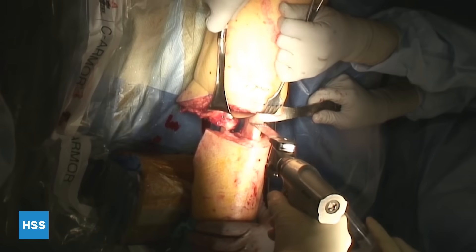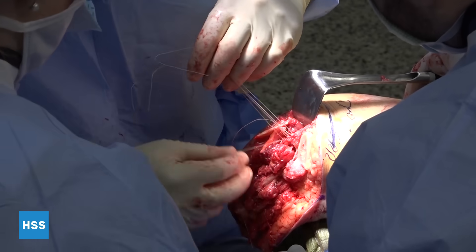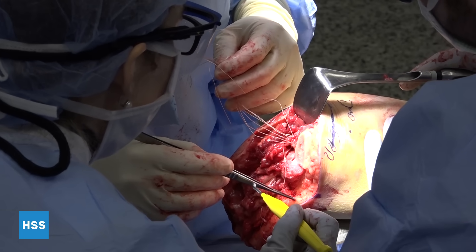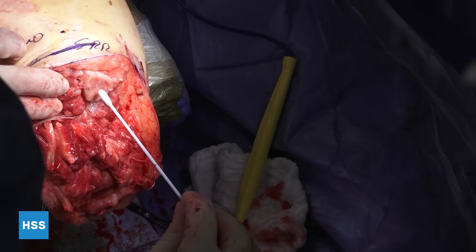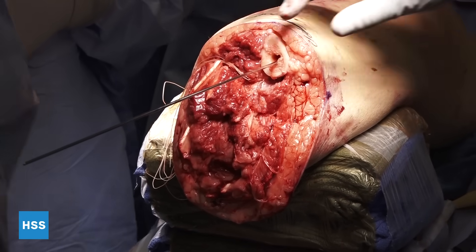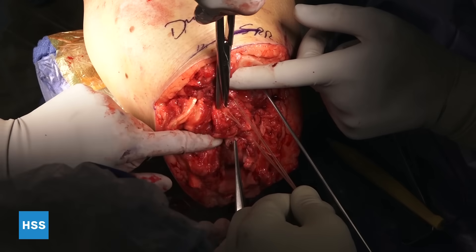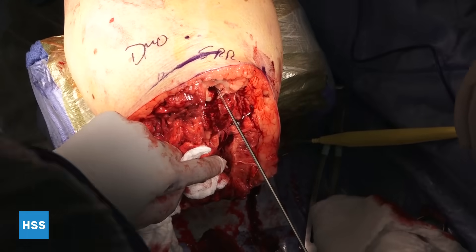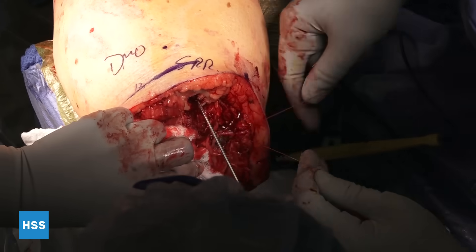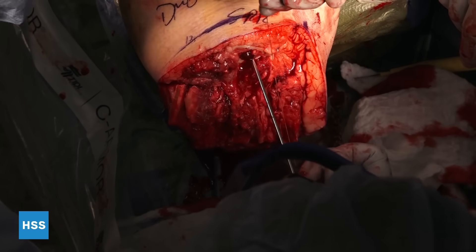After the leg has been removed, we have a cross-section view of the leg. We find the critical neurovascular structures and perform hemostasis. Ligation of the major arteries is performed, and culturing of the bone is done as a routine. Exposure of the main nerves, including the tibial nerve and the peroneal nerve, are performed for later muscle re-innervation, and ligation of all appropriate vessels is performed.